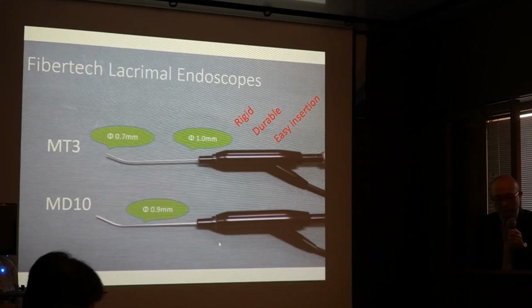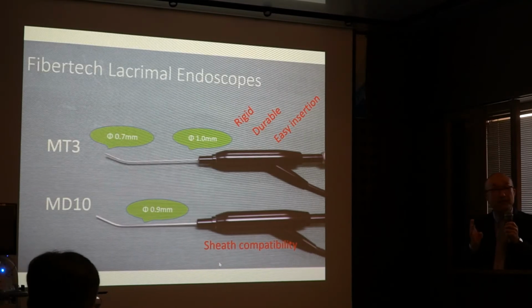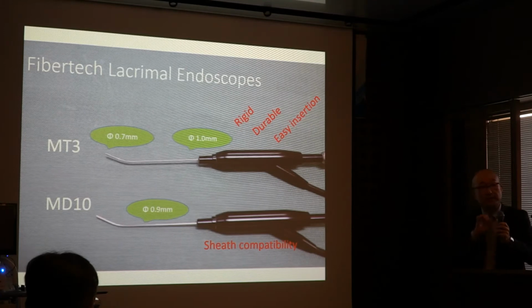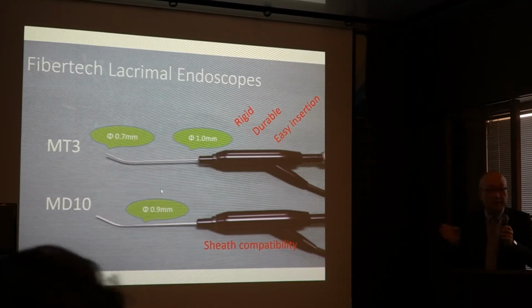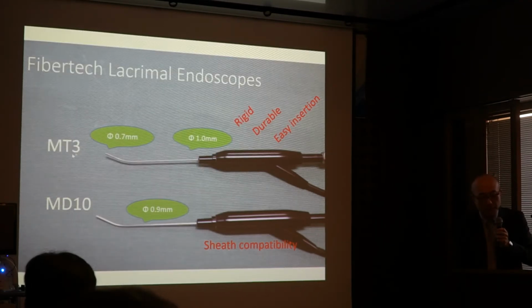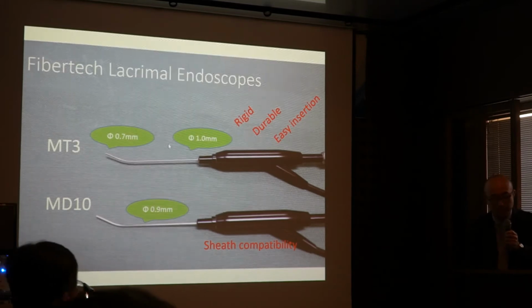However, MD10 has a good sheath compatibility. So for performing the therapeutic dacryoendoscopy, such as SEP or SGI, we need MD10. But for everyday examination, daily routine examination, I use MT3. This is how to use MT3 and MD10.